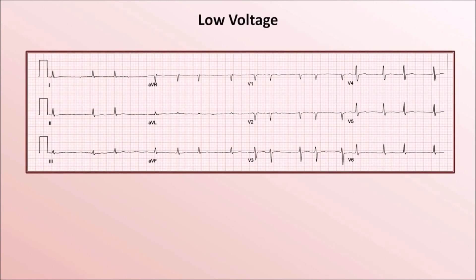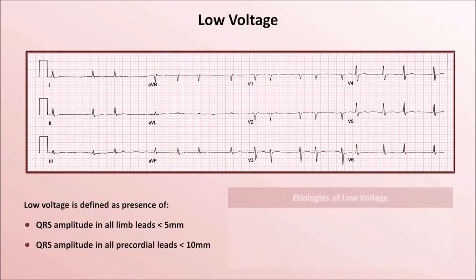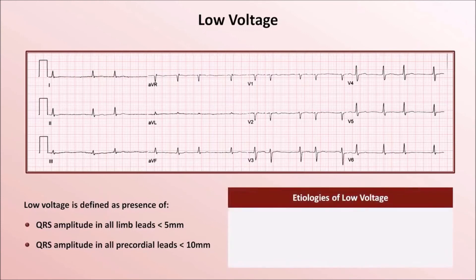There are two last abnormalities to discuss in this video, and these abnormalities typically affect all waveforms. The first is low voltage, as seen here. The presence of low voltage is defined as a QRS amplitude in all limb leads of under 5 mm and/or in all precordial leads of under 10 mm. Low voltage is the consequence of some insulating substance coming between the electrodes on the chest wall and the conduction system.